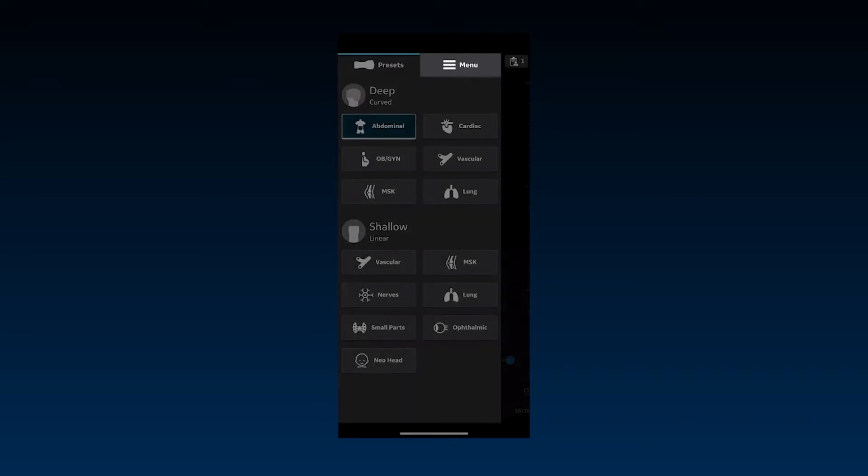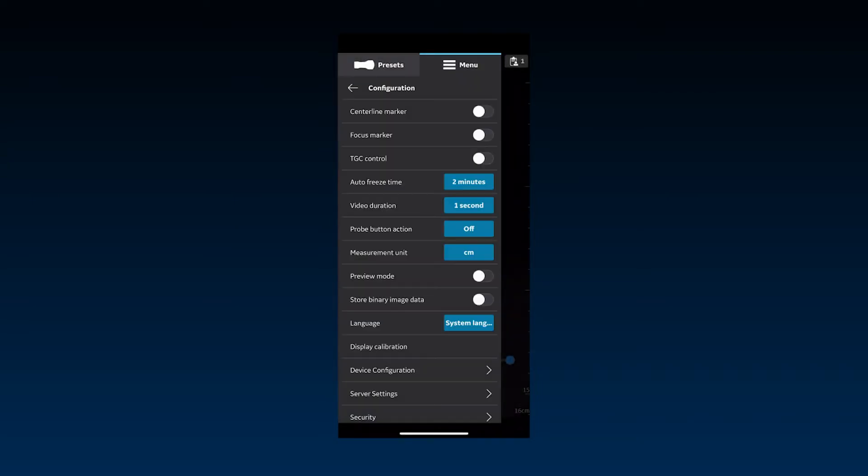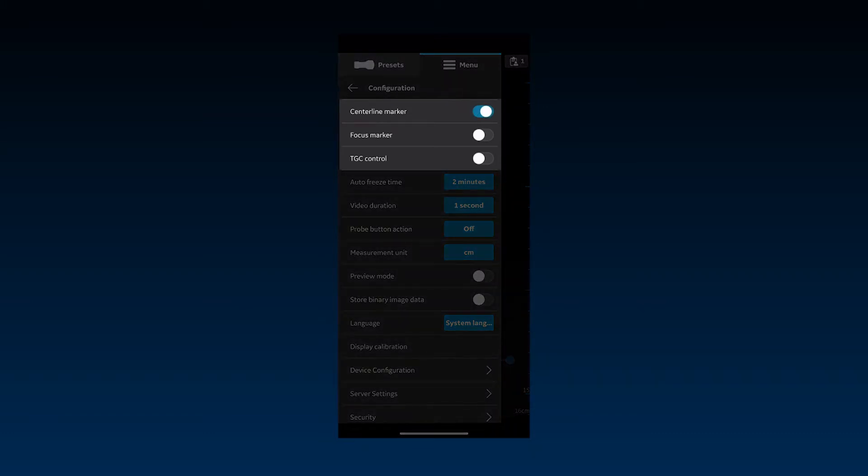The menu starts with configuration options to customize scan-related settings. Display of centerline marker, focus marker, and TGC controls on the image can be turned on or off from here. Please watch the app walkthrough video to learn more about these controls.